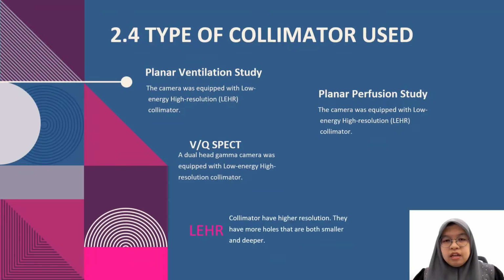For these procedures, the LEHR collimator was used. The LEHR collimator has higher resolution, so this collimator has more holes that are both smaller and deeper.